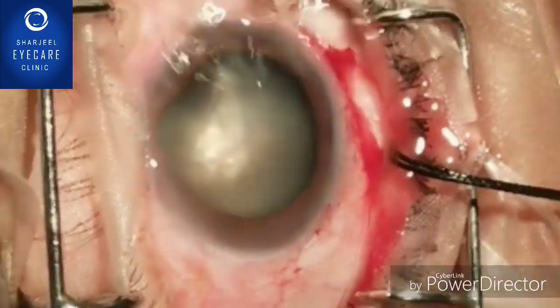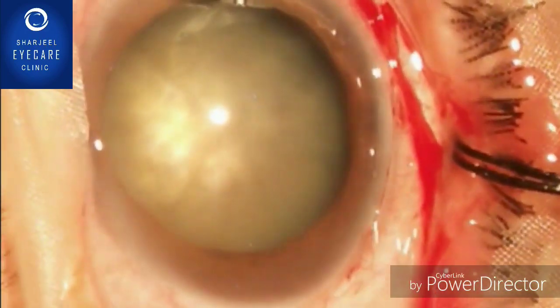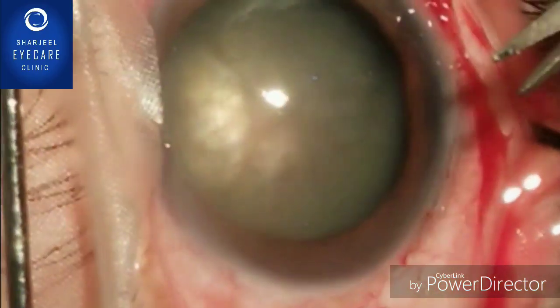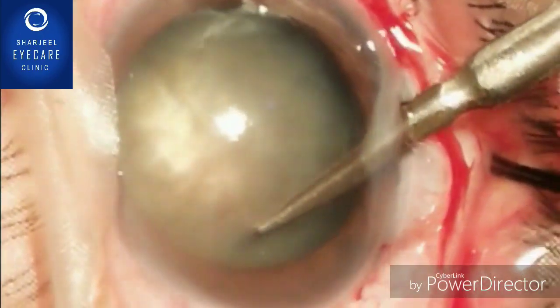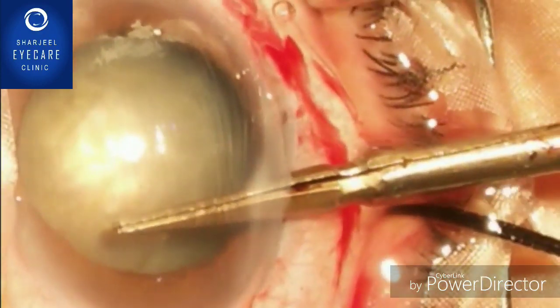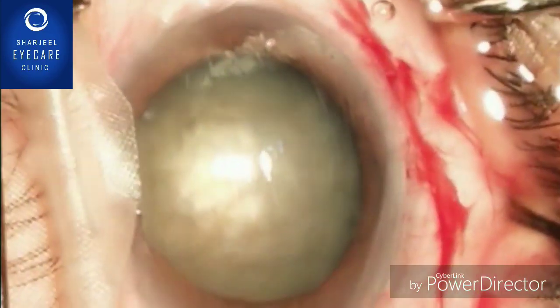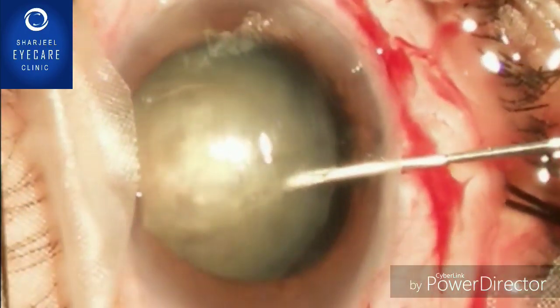Put water on the cornea so it should not dry. The nucleus was very hard so we did not attempt the Vannas scissors initially. Now you can clearly see that with the Vannas scissors, if you cut and do the capsulotomy, it will exert minimal pressure on the remaining intact zonules. That is one of the important points while doing cataract surgery in subluxated hard mature cataracts.